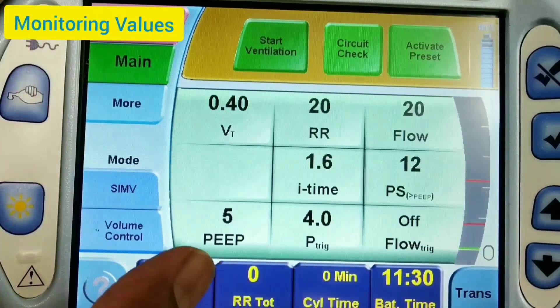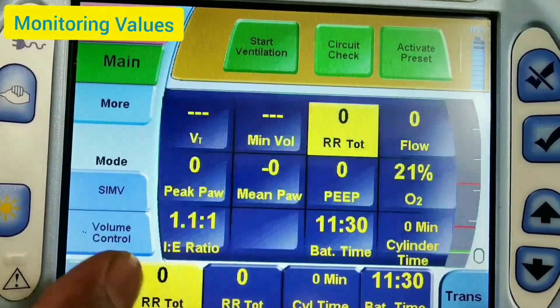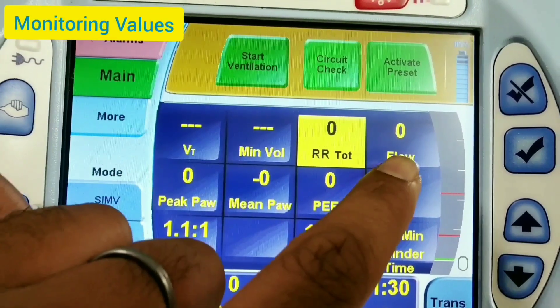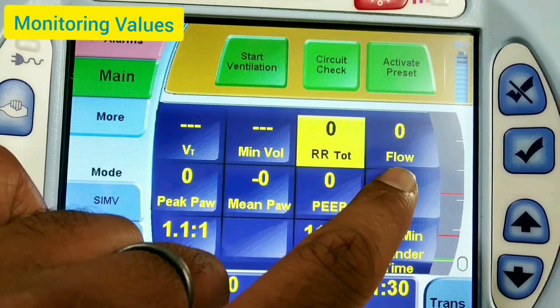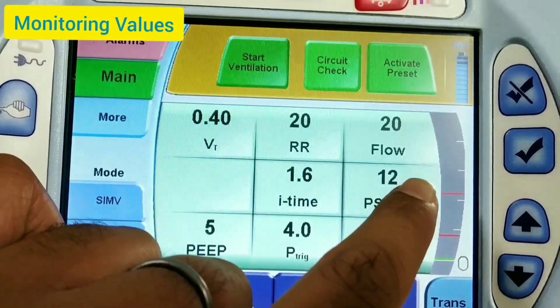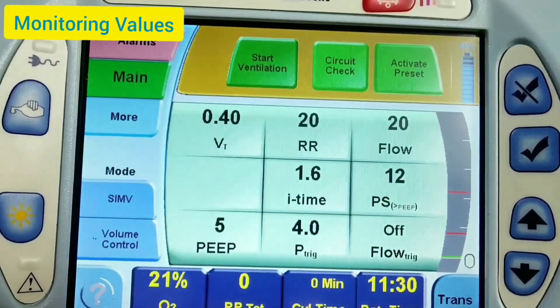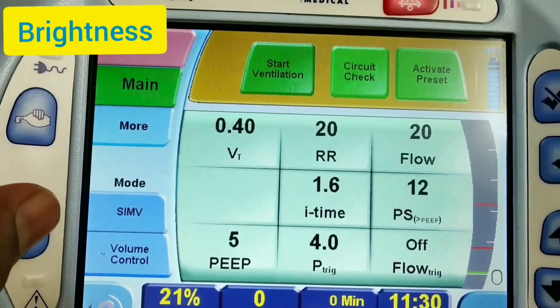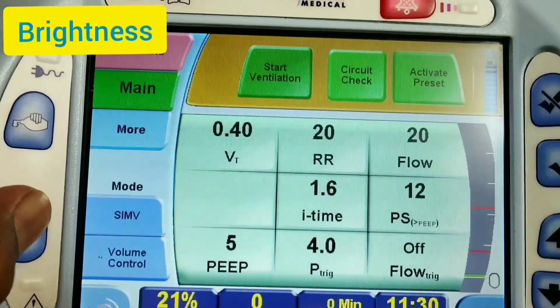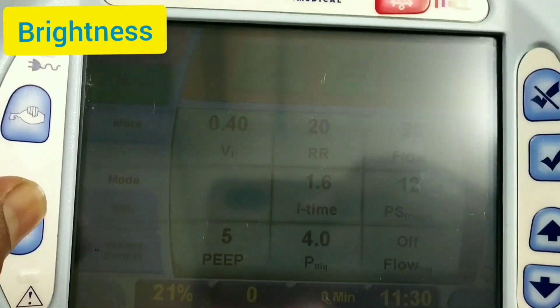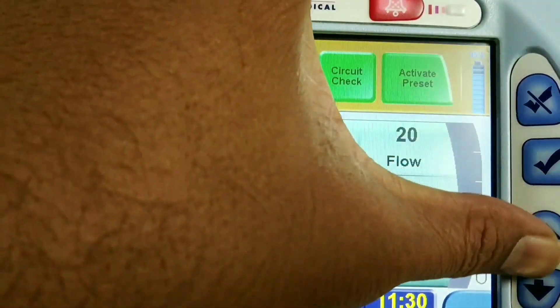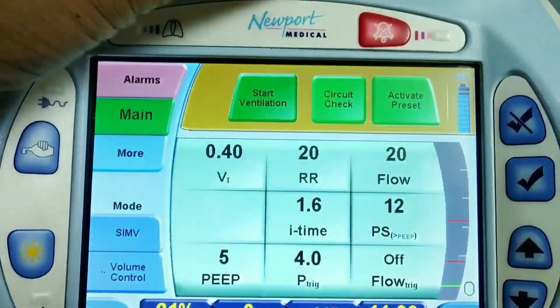For monitoring, four parameters are displayed at a time. Press any of the monitoring buttons and all monitoring parameters will be shown. You can select a specific row — for example, row 2 — and those four parameters will be displayed at the bottom. We can also adjust the brightness using the brightness key. The navigation keys include cancel, accept, and up/down.